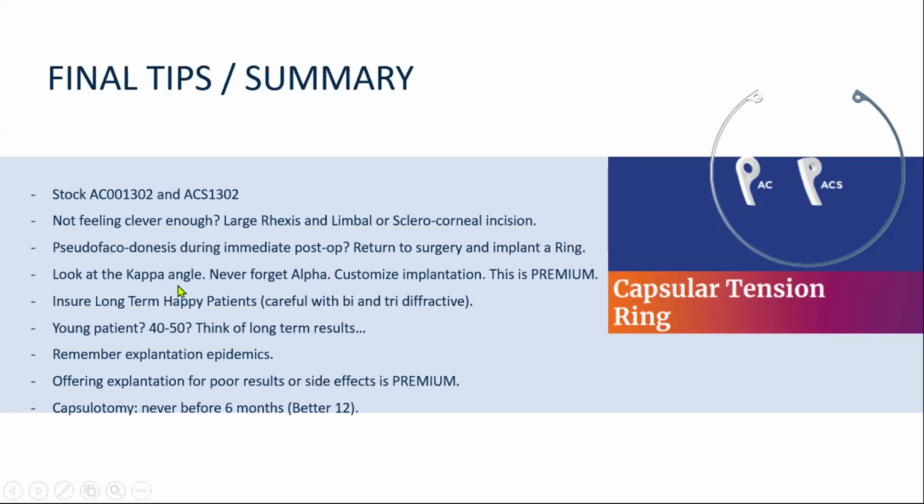Always look at the kappa angle. Never forget the alpha angle. Always customize your implantation. This is premium service. Ensure long-term happy patients. This is one of the most important things in my business.